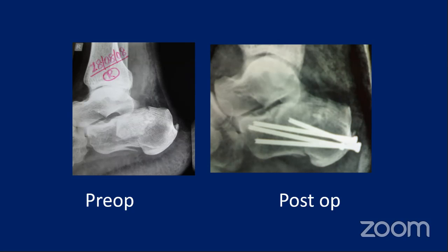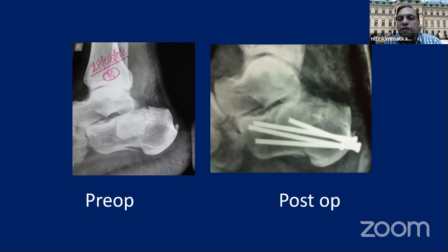Nitin sir, what do you think? Do you think that this fracture is still depressed a bit? Could it have been elevated a bit? It is still a depressed one. Bohler's angle is not very well established, but clinically you are getting a good result, no issue.